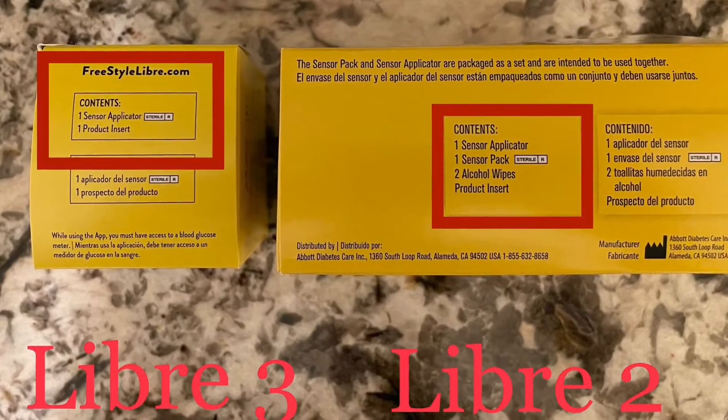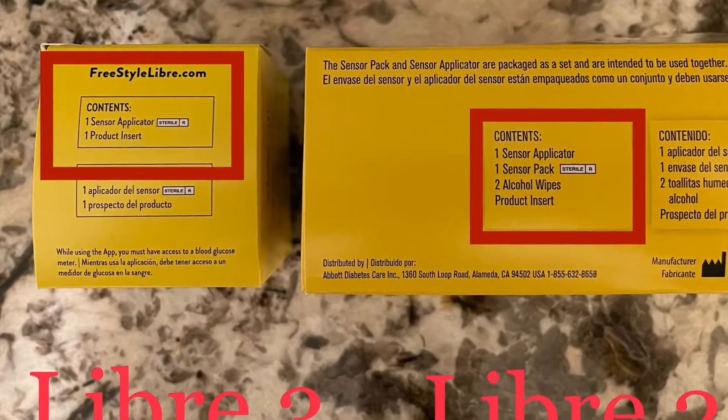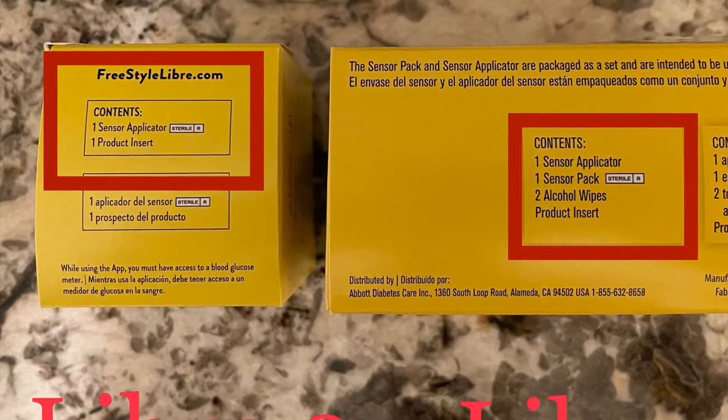What's no longer included in the box — which was a little bit of a bummer — were the alcohol swabs that were included with the Libre 2. That opens up more room in the packaging. It's kind of like how Apple no longer includes charging bricks, assuming everyone has one. Maybe Abbott assumes every diabetic has alcohol swabs at home. Not a huge deal, but just a little disappointing to no longer have that included for convenience.